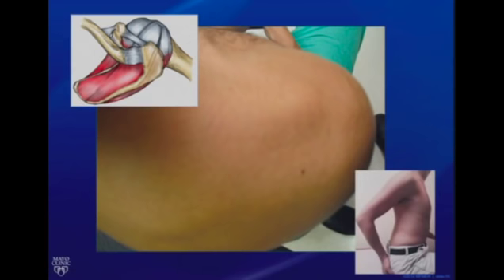Going back to our bird's eye view, you have the patient here who's sitting down on a stool, and at least in our lab, I like to scan from standing behind the patient. From the top, if you look down, you can clearly palpate the bony structure, which is the acromion. Once you've identified the acromion, then it's easy to visualize the anatomy going back to our bird's eye view. And you have to understand that under this acromion lies the supraspinatus tendon.